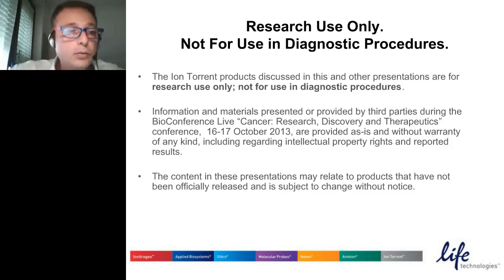Well, as I said, we have evidence that, at least for the hotspot mutations, we can go down to 2%. For mutations that are outside those hotspots, we feel confident that 5% is the limit of detection. Below that, I think we will need some confirmatory studies. I think that LifeTech is also working to improve the sensitivity of the method, and we know it's very important if you want to study tumor heterogeneity.